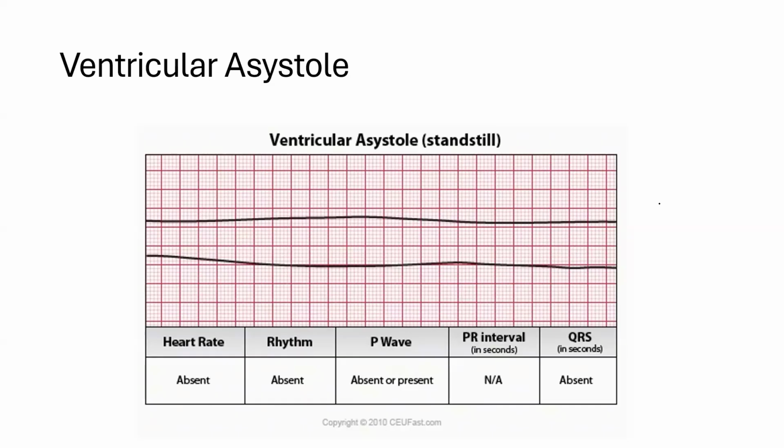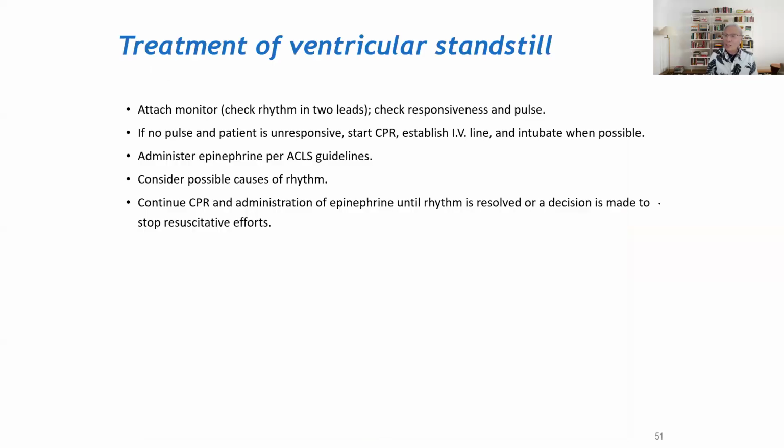Okay? So always, when you see this happening, you need to check and assess the patient. The leads. Okay? You need to assess the patient. If the patient is talking to you, it's not him. It is the machine. But if you go in there and there is nothing, then it is RIP. Then you mean to say that this is a standstill or asystole.